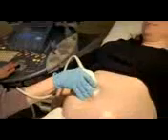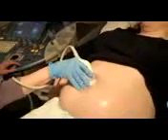The 3D ultrasound is helpful when we're trying to evaluate a fetus who might have a facial abnormality, sometimes even spinal or hand or foot abnormalities. It doesn't help as a 3D mode so much for the inside structure, it's more external structure.